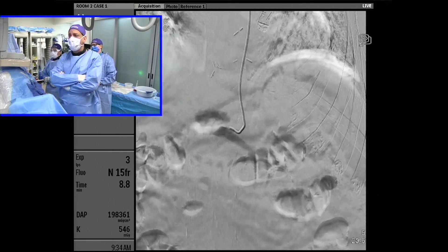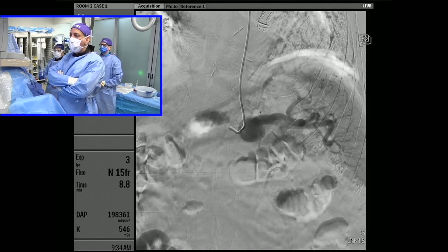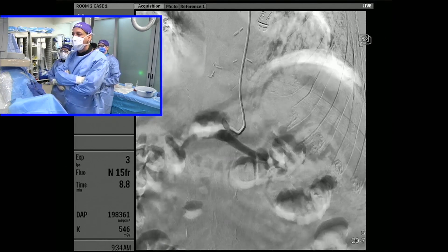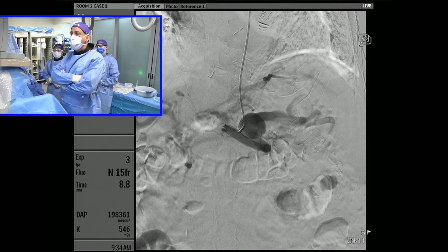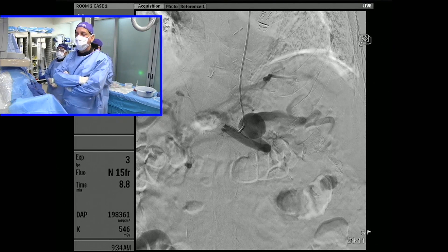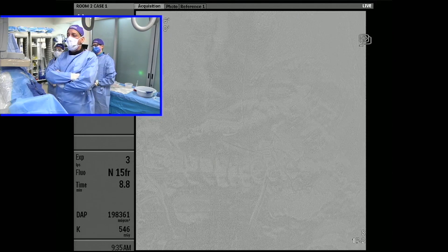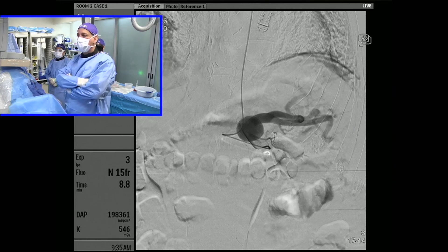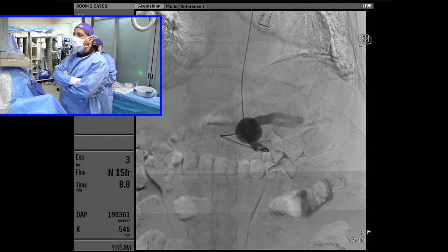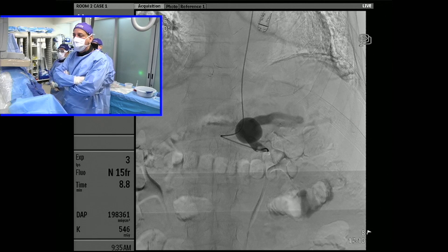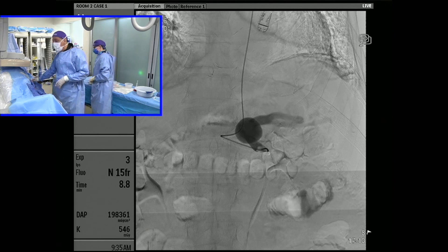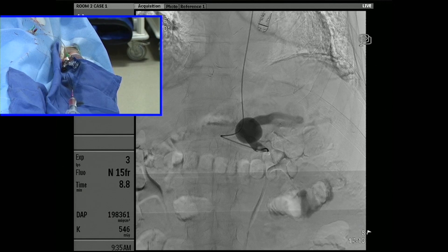Here's our seroradial catheter. We've successfully catheterized the celiac artery, and I think everybody would agree this aneurysm is at least twice to three times the size of the native inflow and outflow vessels. Because the seroradial was hubbed at the wrist — a 110-centimeter catheter with no room to advance — we now have a four French 125-centimeter catheter right at the inflow to the aneurysm. I like this setup; it's a very stable setup with good purchase into the celiac artery. The four French catheter is completely hubbed, and this is where we're going to start our procedure.